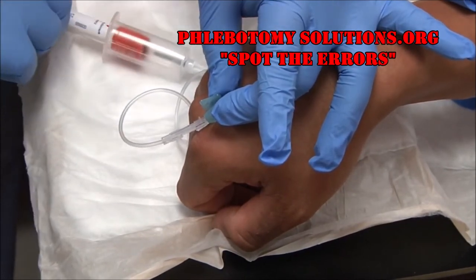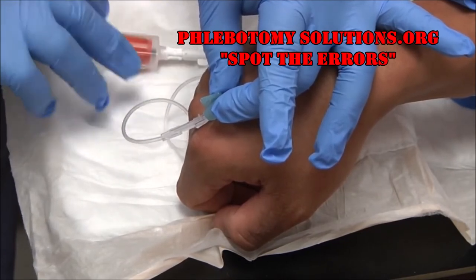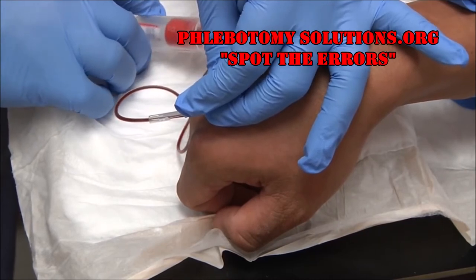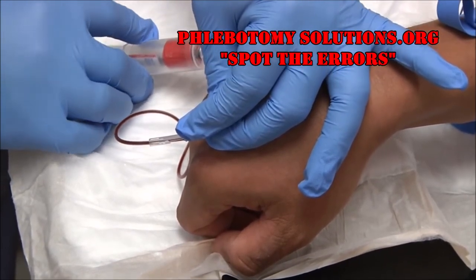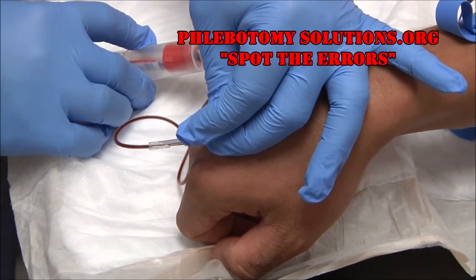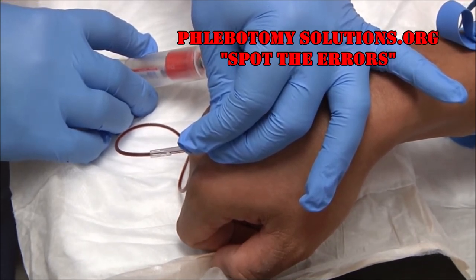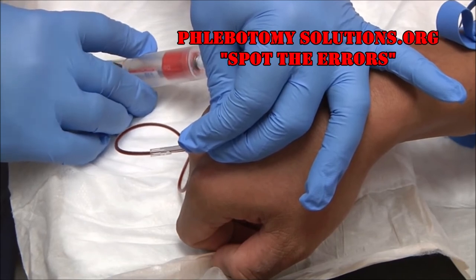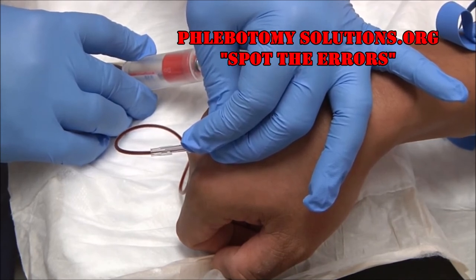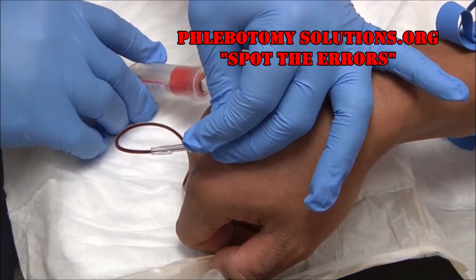Normally I would hold the needle with my dominant hand, but for the sake of the camera I'll do this a little backwards. I have my tube inserted and will go ahead and fill up the tubes. When using a winged collection set or butterfly needle, the blood flow will be a little smaller or slower because the needle is smaller, so be patient. It's always important to fill your tubes completely.